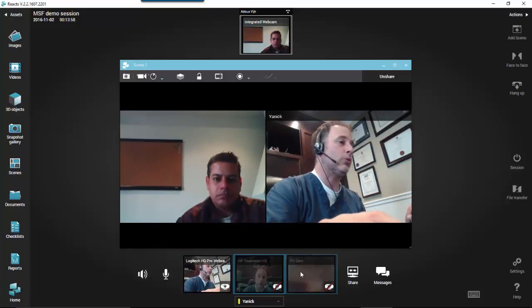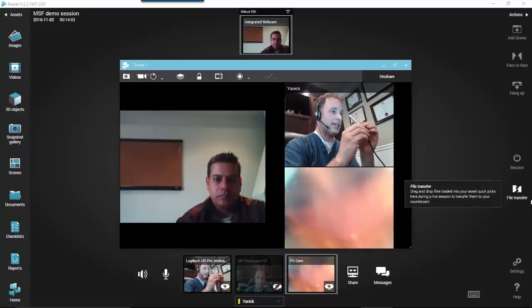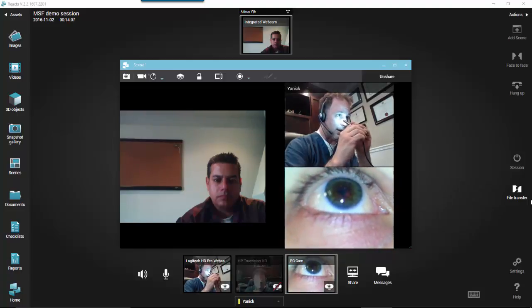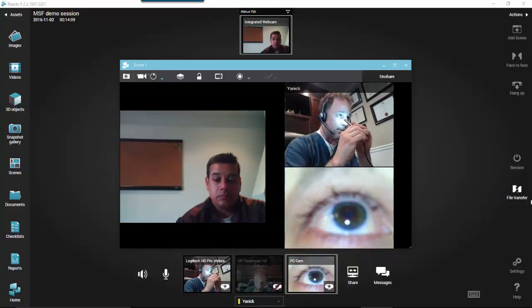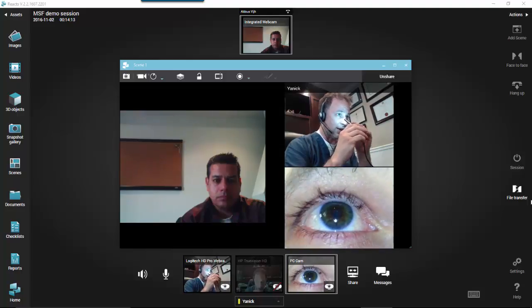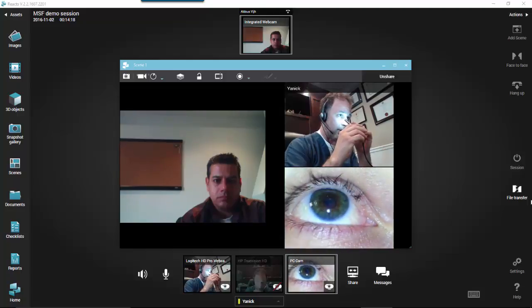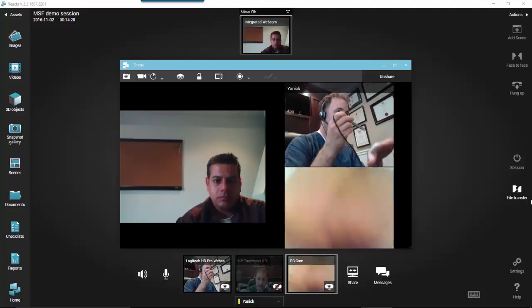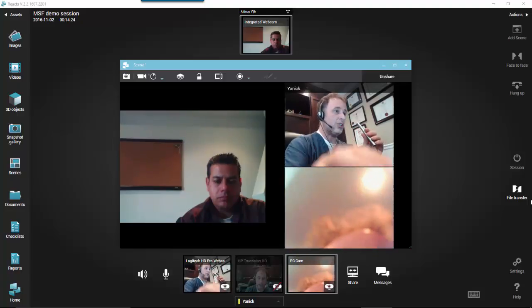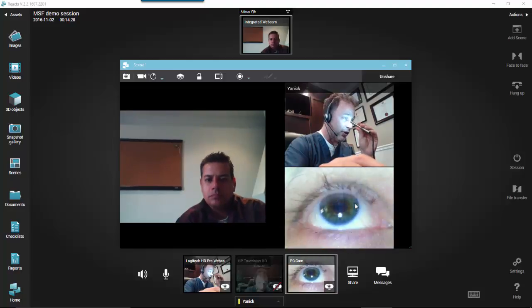Now if I want to show it to my counterpart, I'm just going to drag and drop it under here. And this camera here, turn it around, so I can use it. And I'm going to play with the focus here. So you see it gives a super clear definition. So you can use it for looking in the mouth, looking at the eye, looking at skin lesions. The nice thing, it shows you what I'm doing here with this camera on top, and you can see the video feed at the bottom.